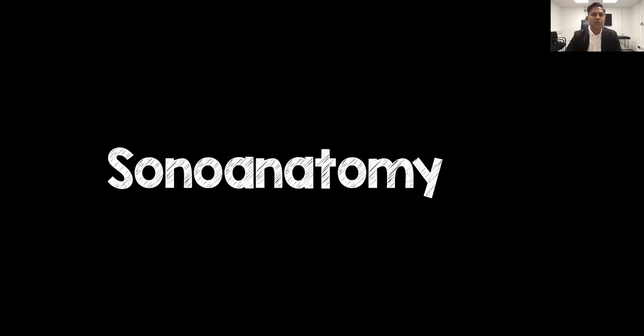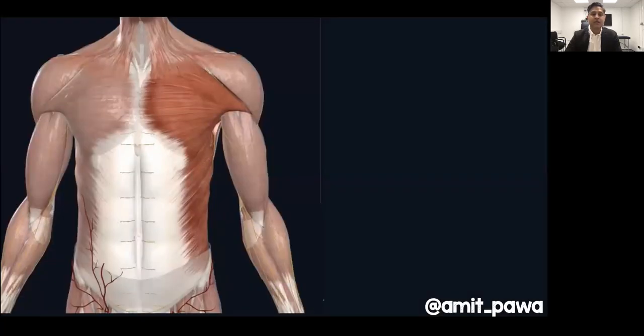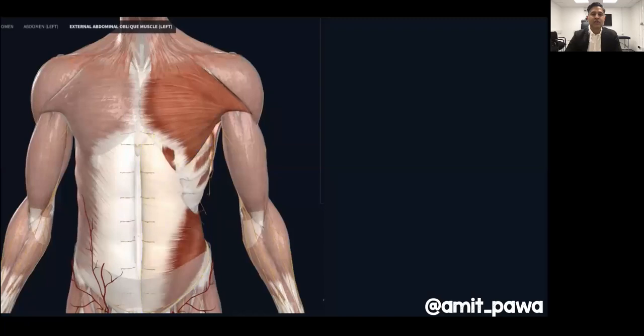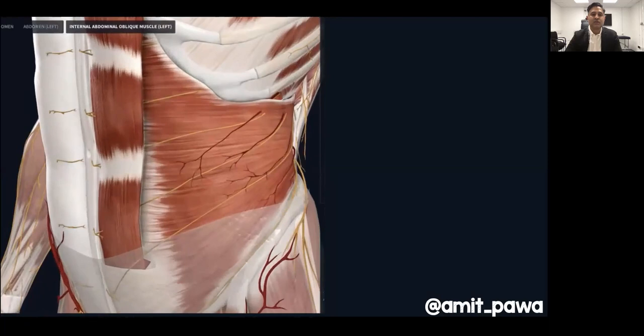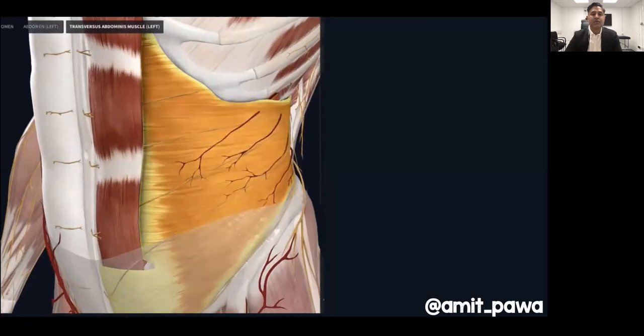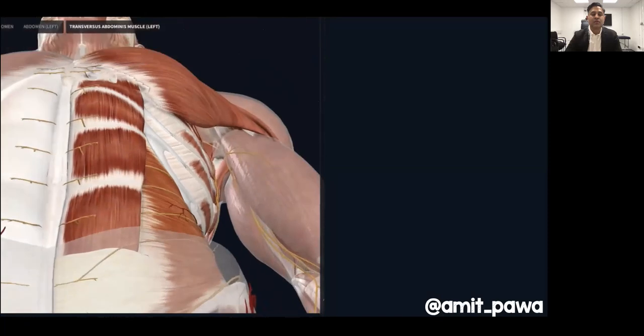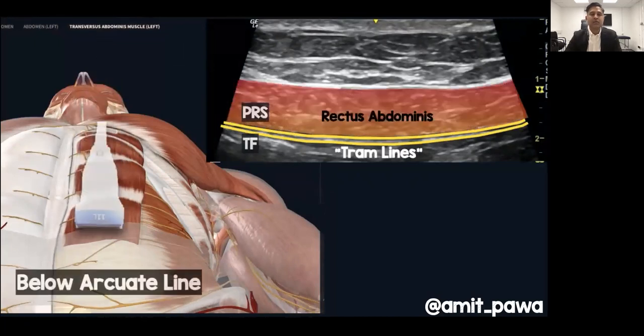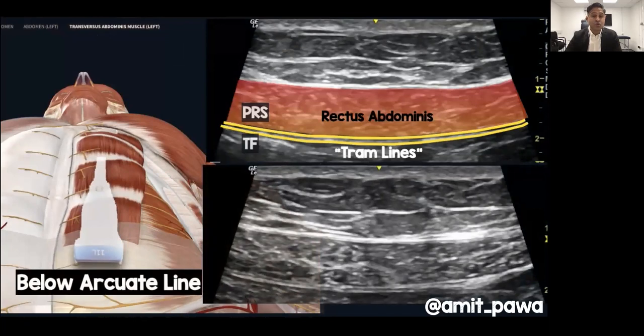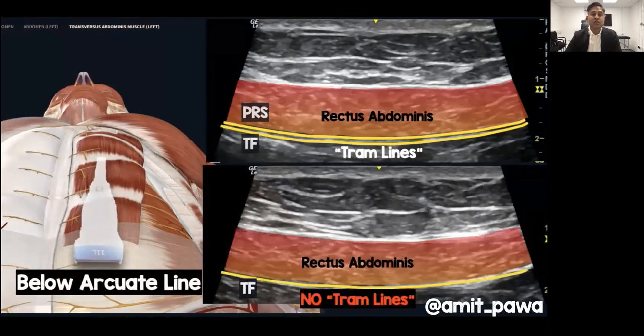What does this look like in sonoanatomy? Here you've got the external oblique and its fascia, the internal oblique and its fascia, and when we remove that you've got rectus abdominis lying on top of transversus abdominis. You can see the nerves we're blocking lying between transversus abdominis and the internal oblique. Placing a probe in the upper abdomen shows the posterior rectus sheath and transversalis fascia forming a tram-line appearance, but sliding below the arcuate line — where there's no posterior rectus sheath — the tram lines disappear and we just see rectus abdominis lying on top of transversalis fascia.